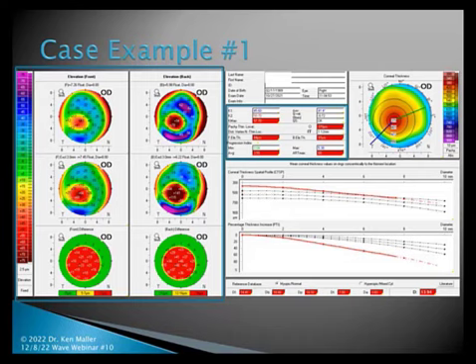And then down at the bottom of that box there, you have the progression index, which is, again, another statistical analysis to allow you to understand if you're dealing with keratoconus or something that may be masquerading like keratoconus. That minimum and maximum that are in green and blue, you can see those lines on the corneal thickness graph just to the right of that. Those are the values, and what they're pointing at has to do with the progression of thinning. So the green line is where it thins the least, progressing from the center to edge, and the blue one is where it progresses the most, or the most thinning from the center to edge. And those are summarized by that ARTmax.